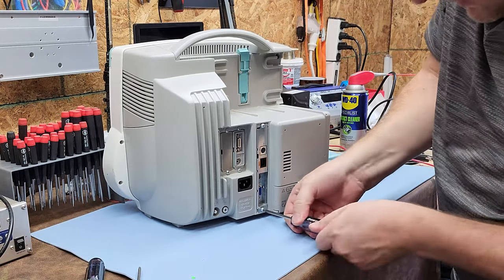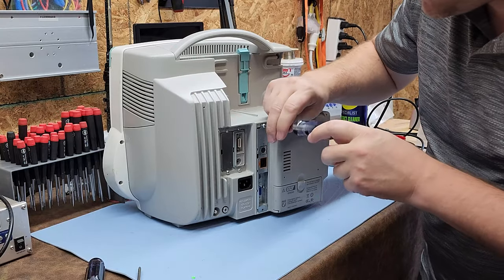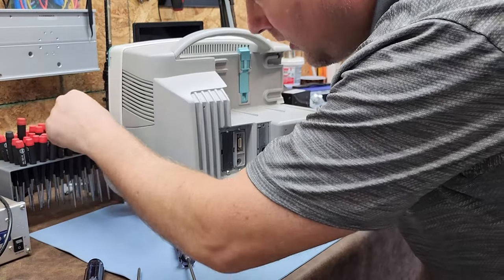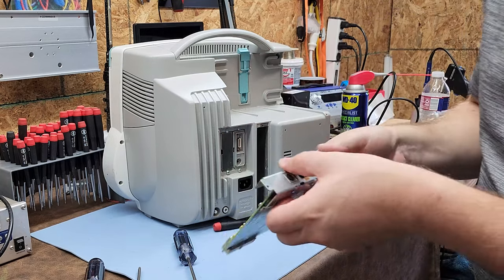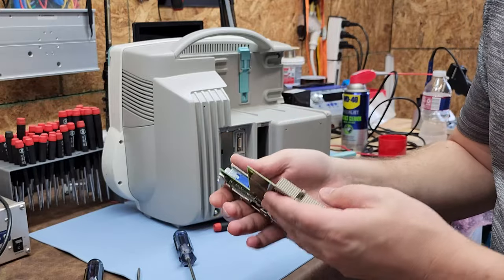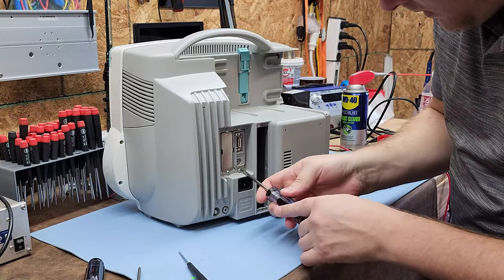I'm going to pull these interface cards first just to see what they look like. Since this is a dissection rather than a proper repair, let's go ahead and pull them out. Here is the network card — you can see it has a huge backplane connector, a multi-pin backplane like you'd see in ultrasounds. Pretty cool that they used that here.